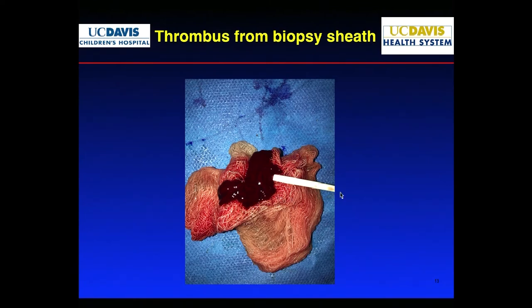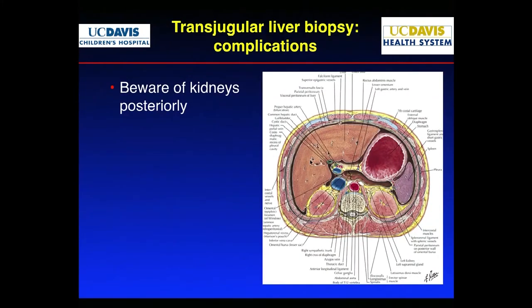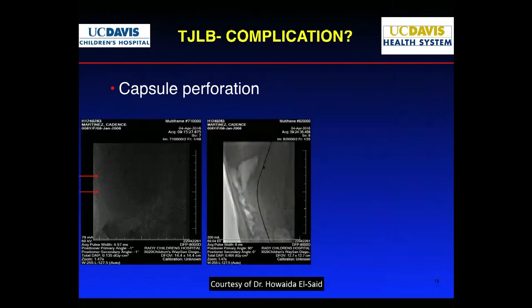So you have to pay attention to this if you choose to do it before giving heparin. So here's the anatomy in cross section. I want to just point out, here's the kidneys, right? It's always behind the liver. So you don't want to turn that curve posterior. You want to stay anterior so that it stays away from the kidneys.